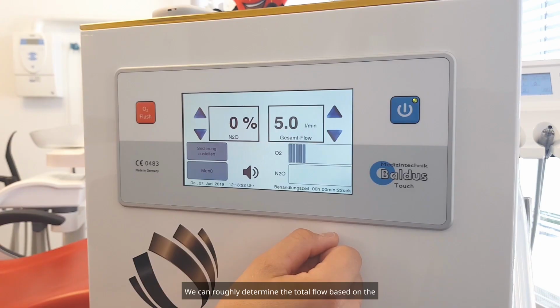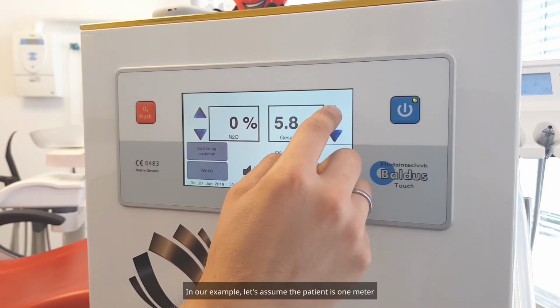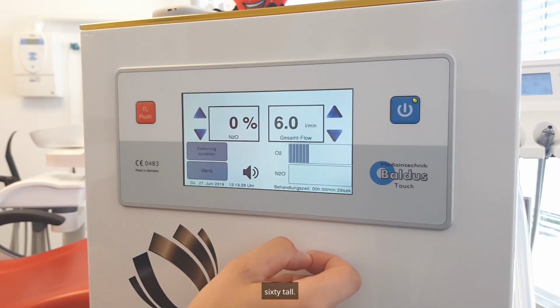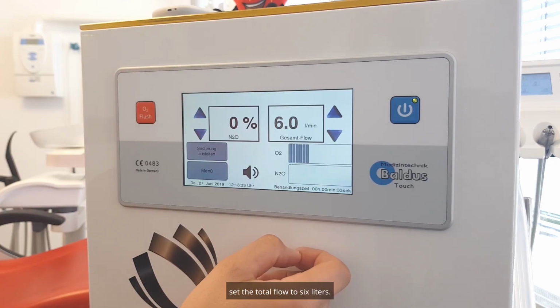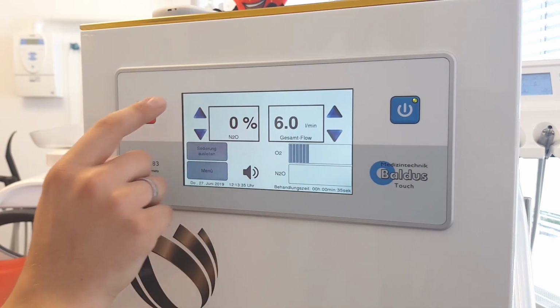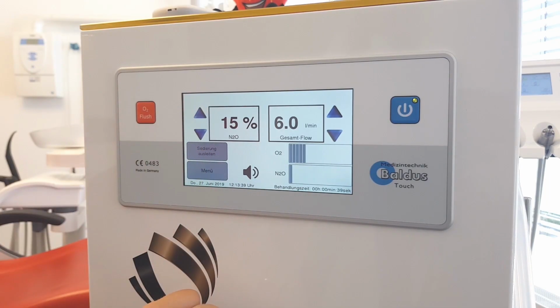We can roughly determine the total flow based on the patient's height. In our example, let's assume the patient is 1.60 meters tall. This means we drop the 1 before the decimal point and set the total flow to 6 liters. Now we begin the sedation with 15 to 20% nitrous oxide.